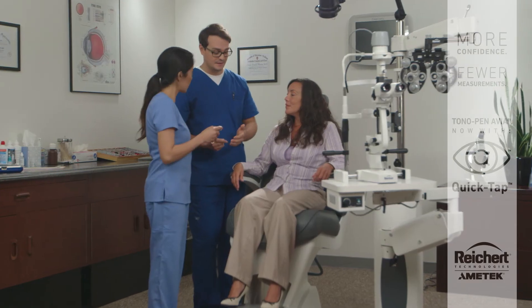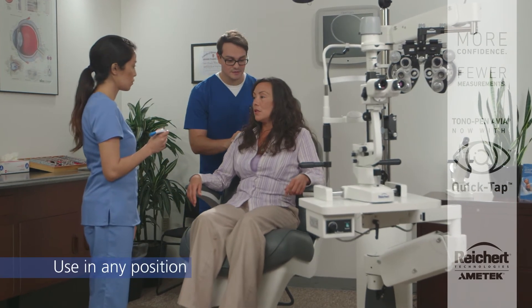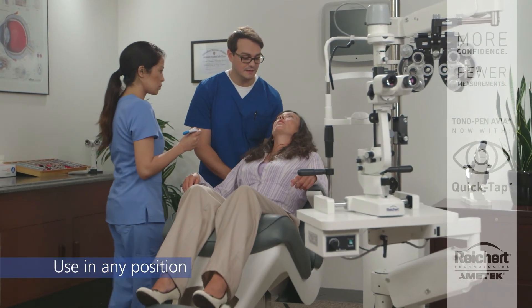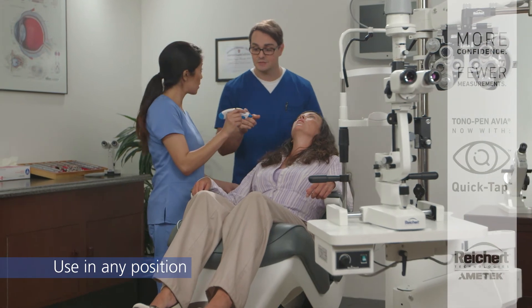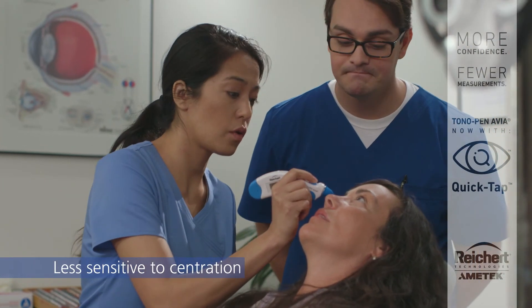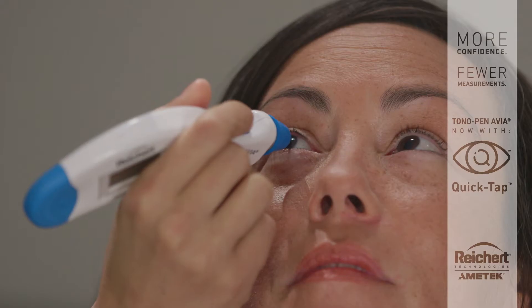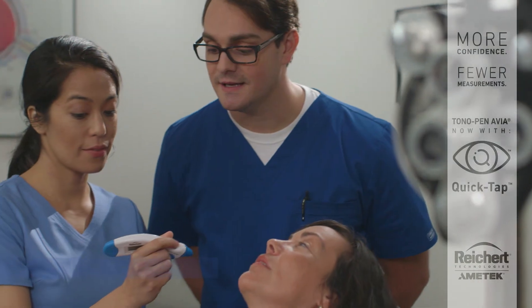Now it's Amy's turn. Tonopan Avia is gravity-independent and can be used on patients in any position. Its microstrain gauge technology is less sensitive to corneal centration than other tonometers, and provides fast, accurate, and repeatable results with minimal operator bias.